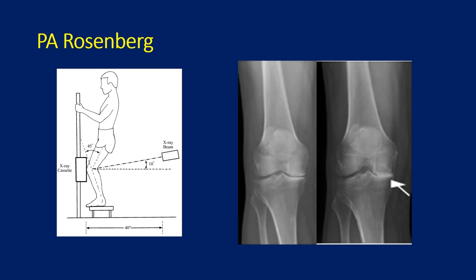The final view is the PA Rosenberg view. This is an often neglected view because people don't quite understand it. The image on the left shows a patient with their knee bent 45 degrees and the x-ray beam angled down 10 degrees, and this shows the condyles of the knee joint. On the x-ray on the right you can see a standard AP view showing some medial compartment narrowing, and then the Rosenberg view with a right arrow showing the posterior femoral condyle contacting the tibia. The Rosenberg view is very good at looking at the back of the condyles and putting those in contact with the tibia.